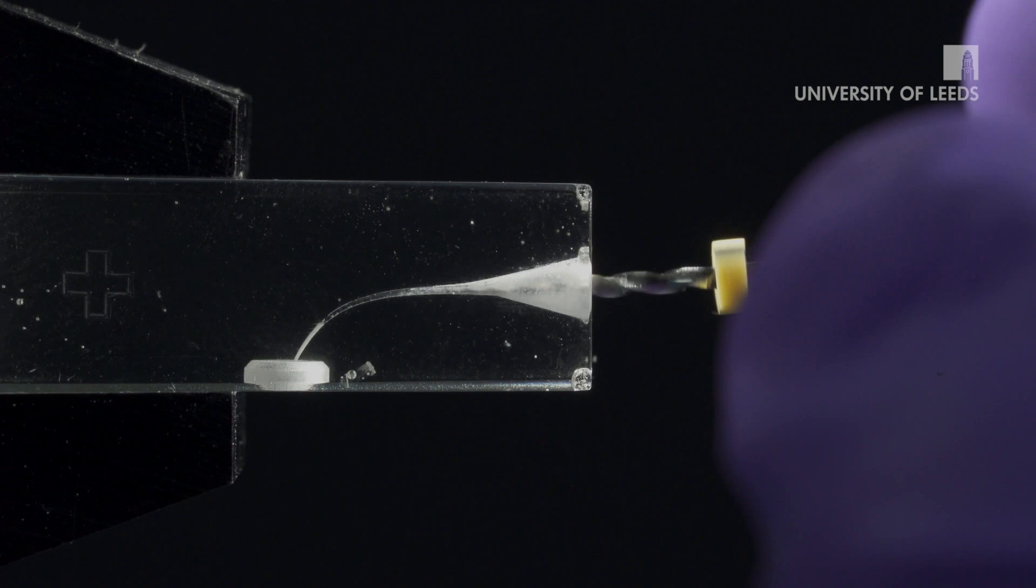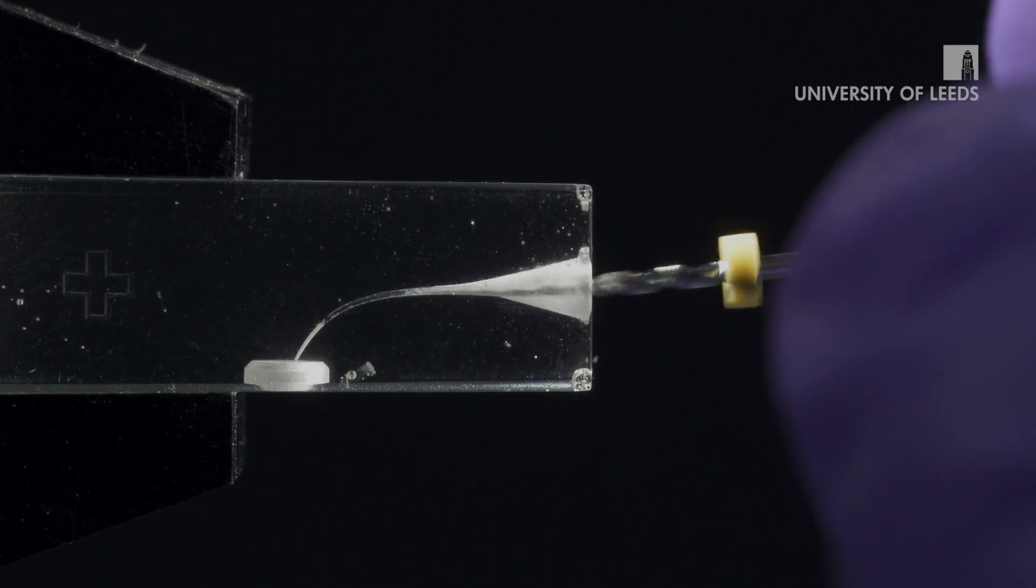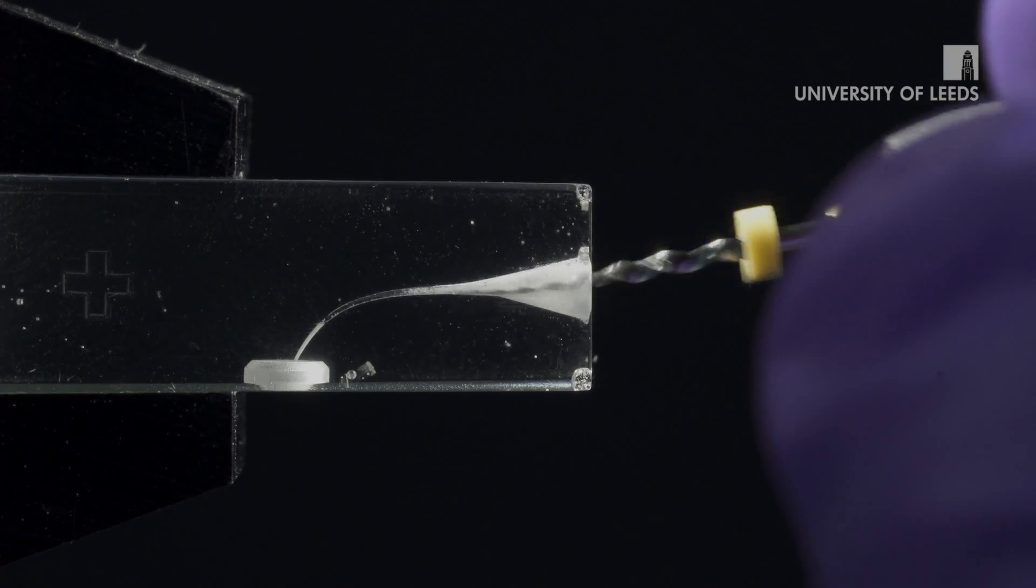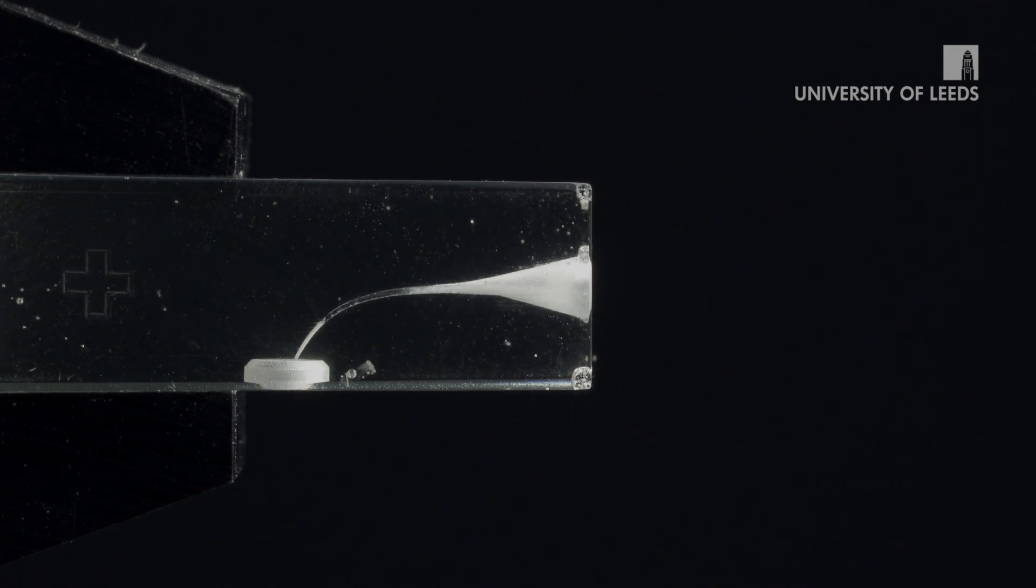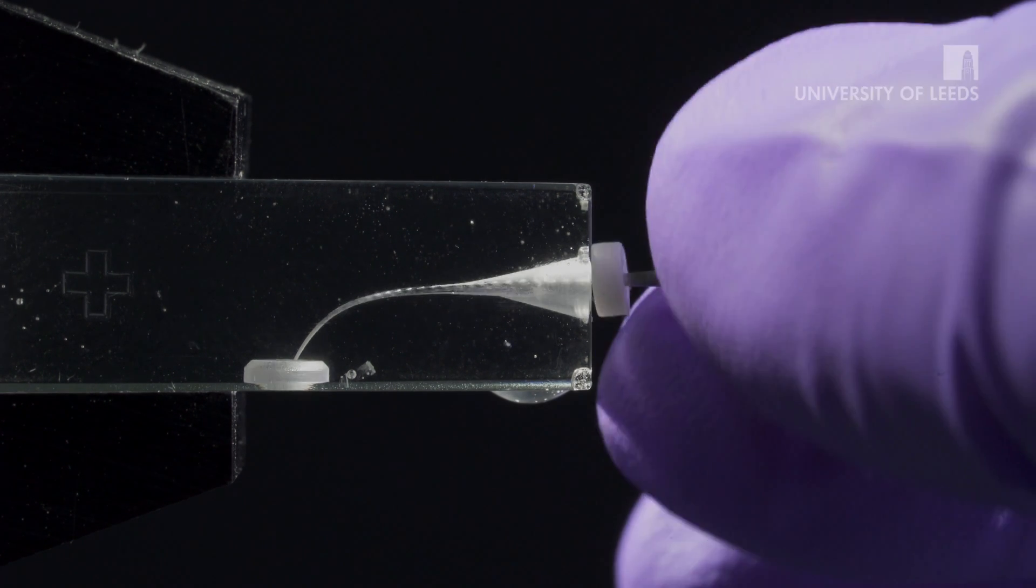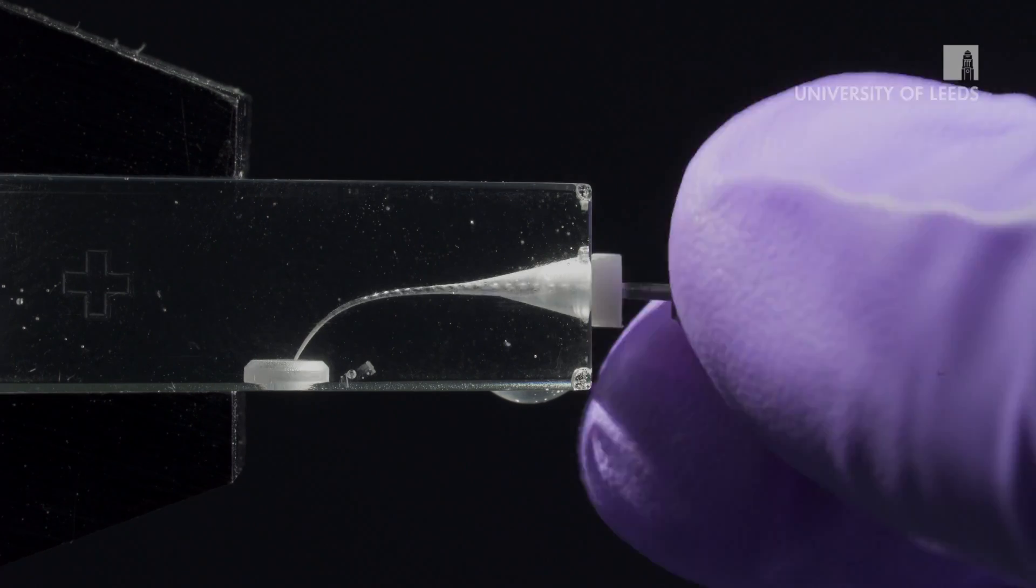This motion is repeated until sufficient coronal shape is achieved. You will notice that as the coronal flare increases, the file will automatically penetrate further into the canal. Once the coronal portion of the canal has been prepared, the apical glide path can be prepared.